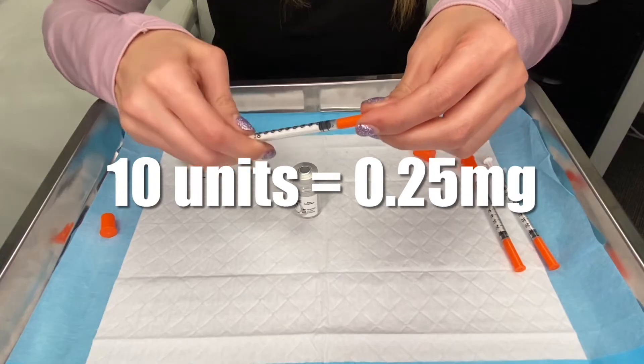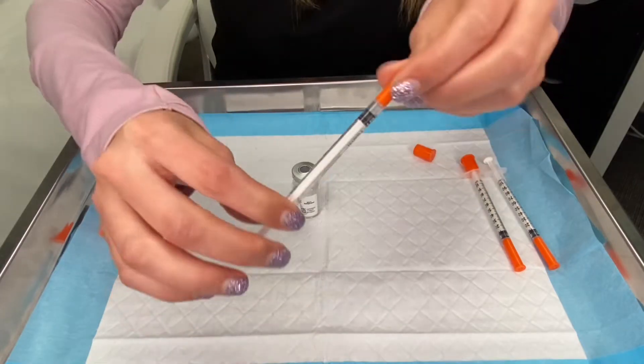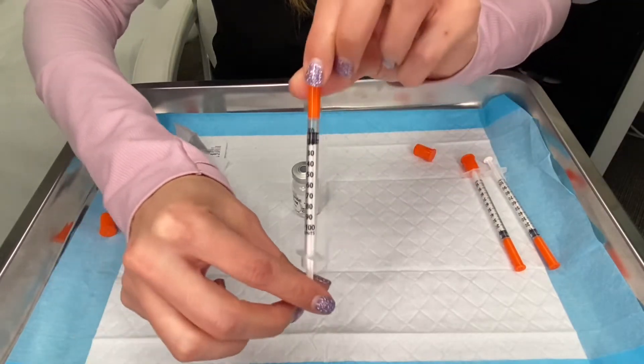For the first month, the dose is 10 units, and on the syringe that is 10 units. When you pull back on the plunger — this is the plunger here — when you pull back, you can pull back to the 10 unit line.